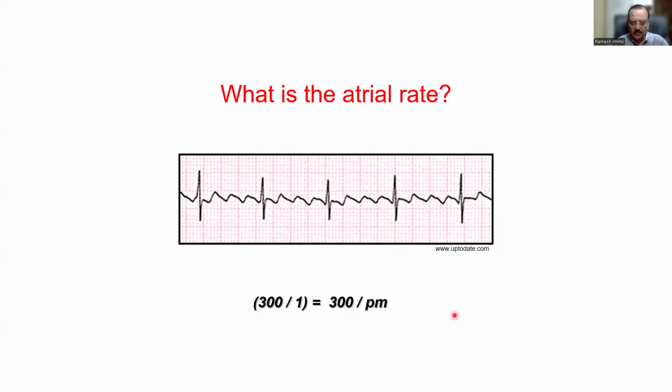Suppose we find many situations where the heart rate is irregular, for example atrial fibrillation. You find irregular rhythm: one QRS, suddenly a long pause, another QRS immediately, some gap. That is typically what happens in atrial fibrillation. When you have it like this, then you cannot apply this formula. Then you have a different formula there, right?